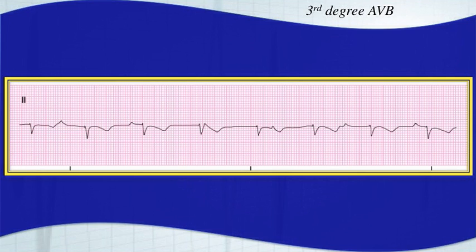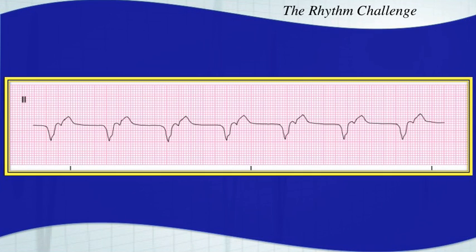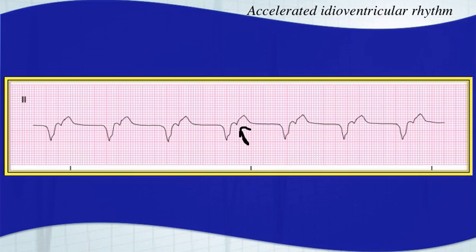Here's your next arrhythmia. Make sure you hit pause and try to interpret it. This is an accelerated idioventricular rhythm. Those are retrograde P waves, which can occur with ventricular rhythms. This fits the rate of about 60 beats per minute, which is an accelerated idioventricular rhythm. Very wide QRS complexes.